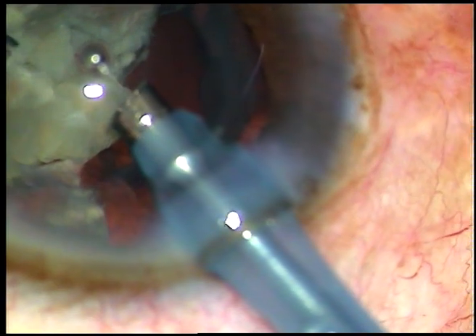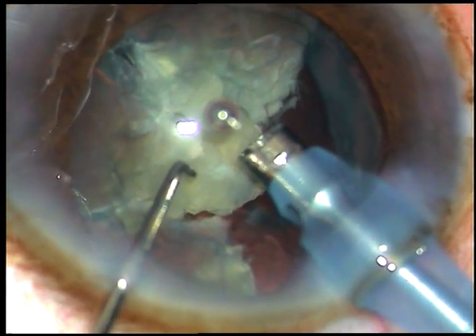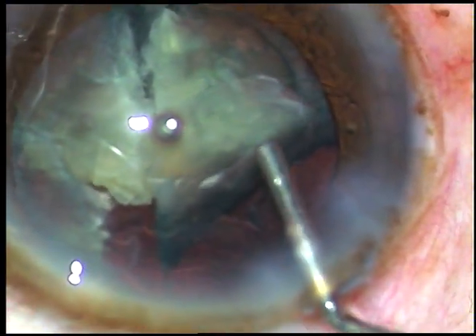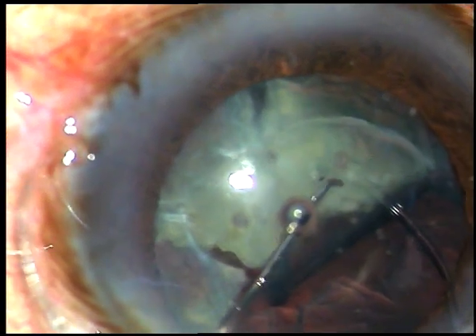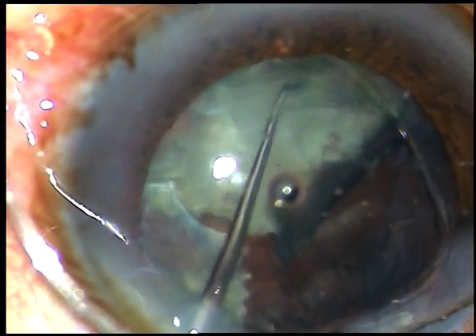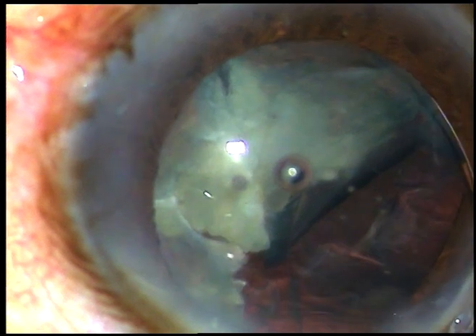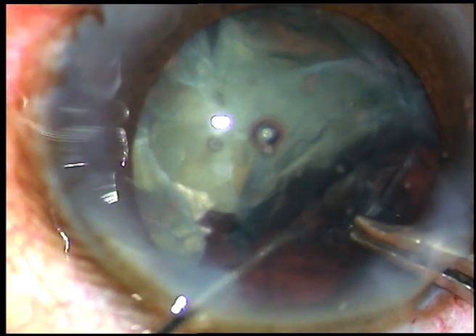Here I find that there is something wrong. Some vitreous strand came into the tip of the phaco handpiece. So what I do is I come out, inject some viscoelastic, and then apply a CTR, so that the vitreous strand that came at the tip of the phaco handpiece goes backward. I hope once the bag gets supported, the vitreous strand will also go to the periphery.